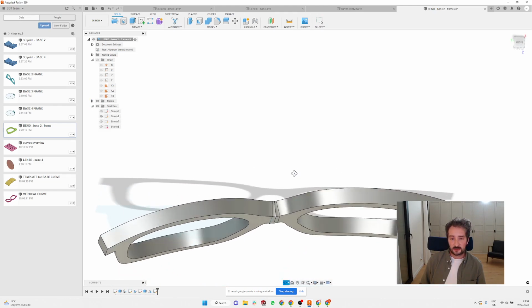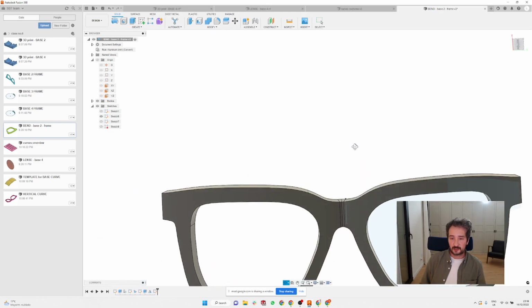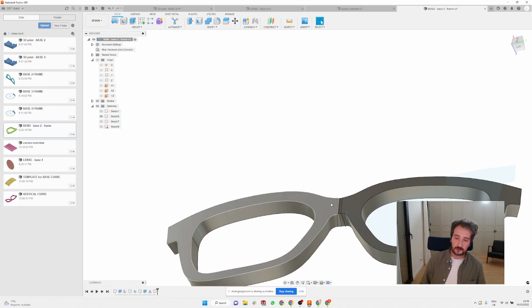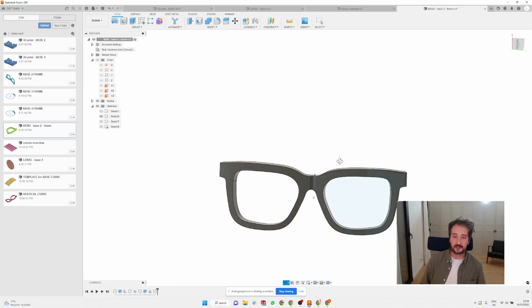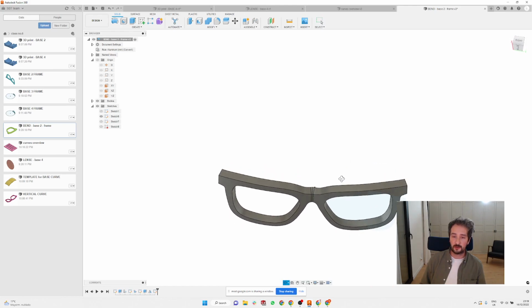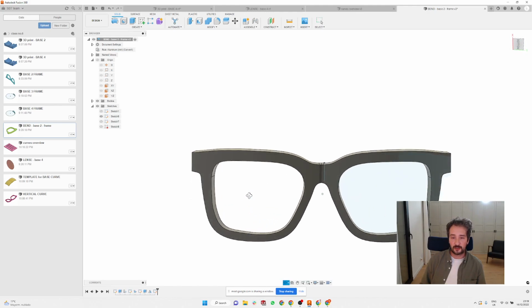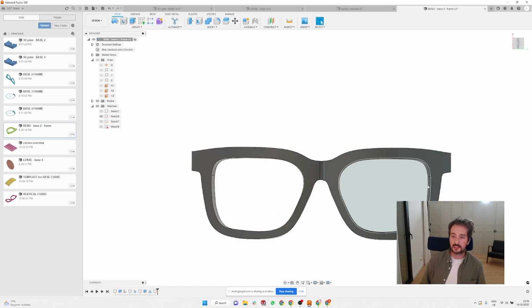So you can see now it has this curvature. I haven't figured out a good way to also model the bridge bump here, but I'm going to try to figure it out later and share a short video. But you can see that all the edges are actually curved inside, so it means the frame is actually bent. It's not just extruded in a curve, it's bent in a curve.